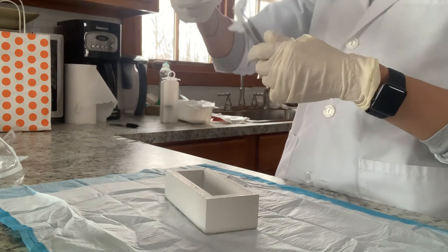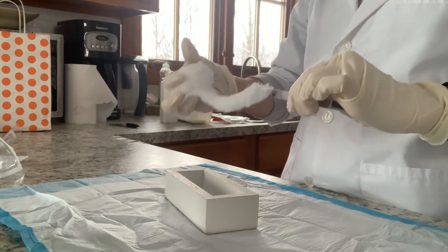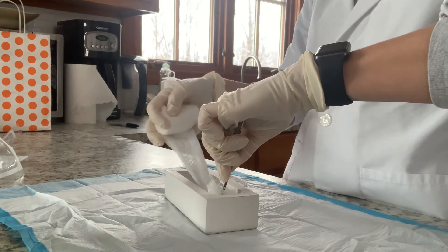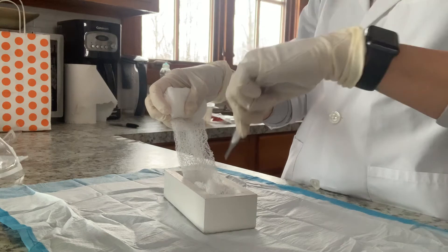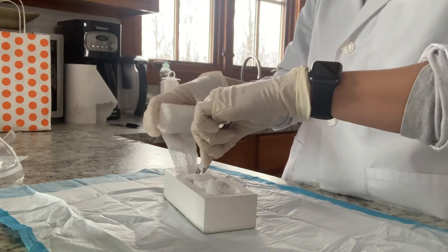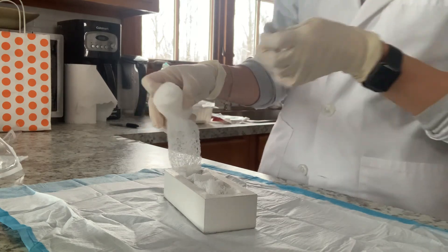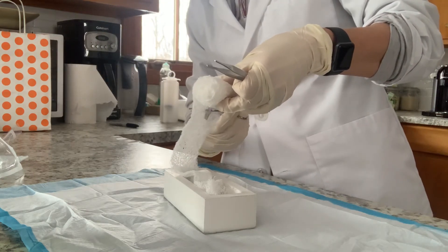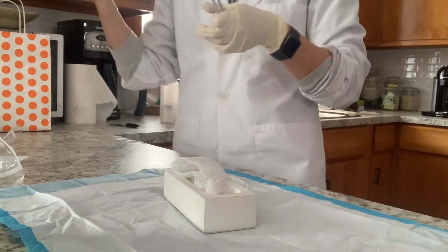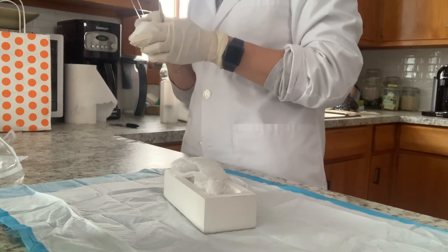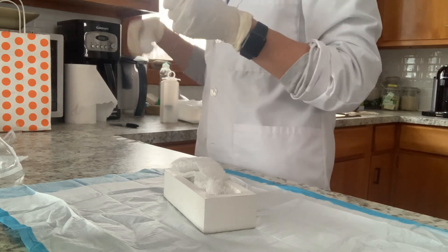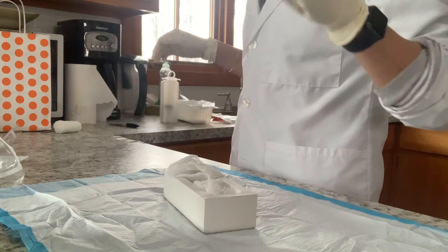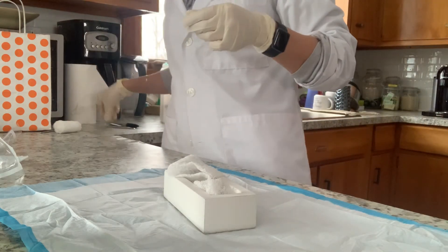Again, we would gently pack the wound and you wouldn't touch the bottom of the wound with the tweezers or anything because you don't want to cause any more damage. So you're going to leave a little bit of gauze to leave a tail so that the next person that has to do this will have a tail. You could throw this in the garbage. So we'll just pretend that I threw those in the garbage. So make sure that our tail is nice. Again, we would dispose of these as necessary.